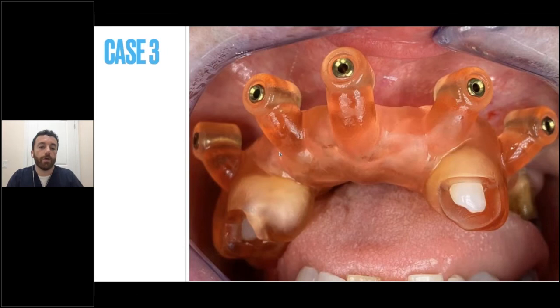And let's walk through some of the steps again. So again, we're going to confirm seating of our guide. You can see between the last picture and this one, we've lost some of the front teeth because of the COVID shutdown. The patient ended up losing a number of front teeth. So we had to take new records on the most stable teeth, which were then used to stabilize the guides.